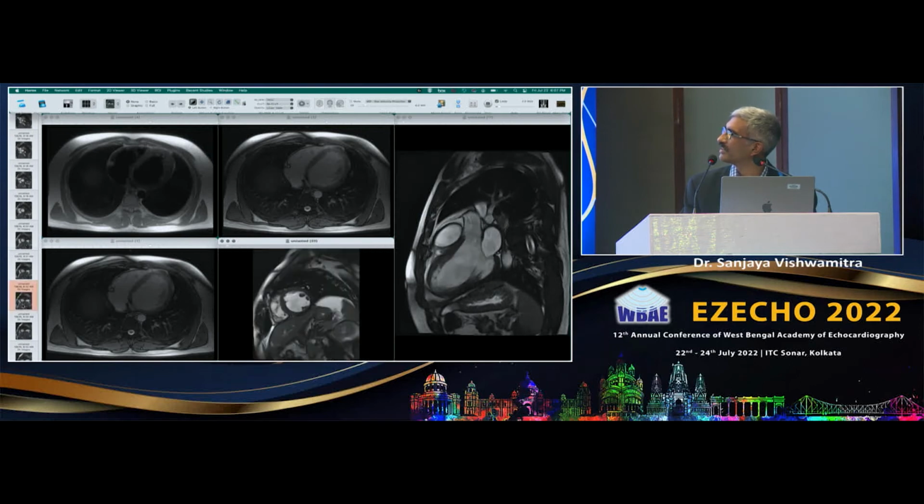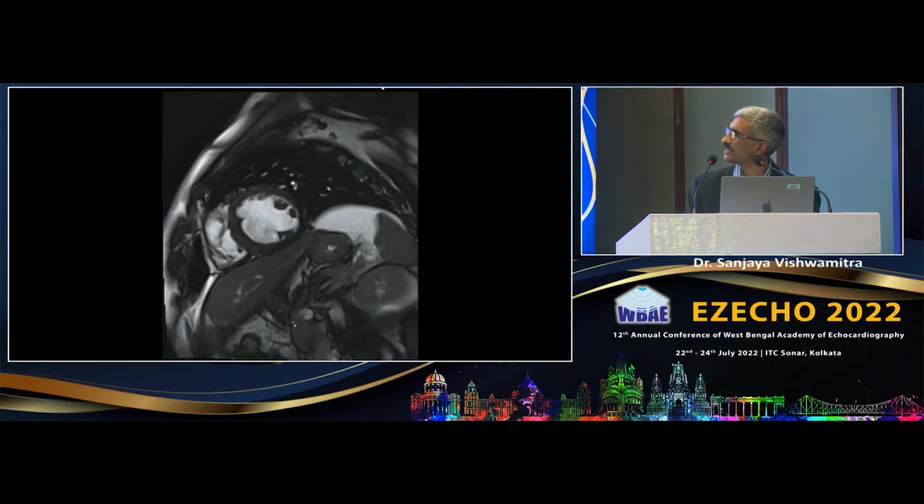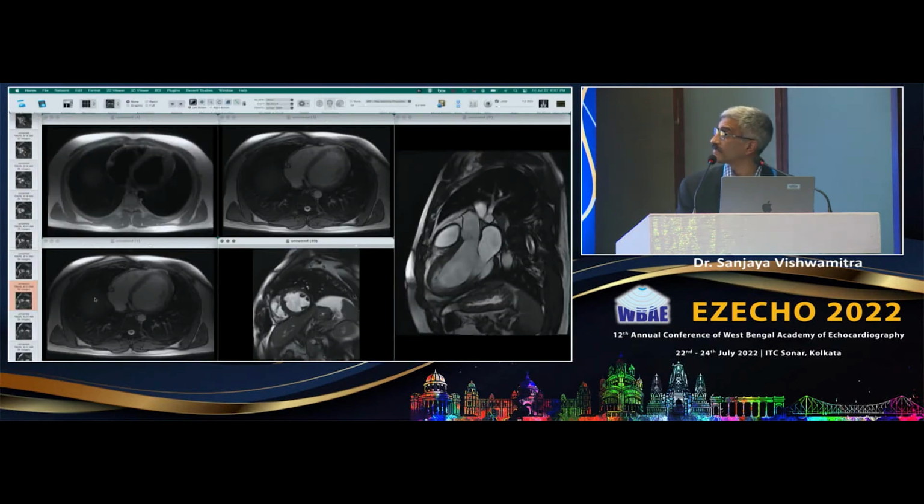What's this one? Okay. So this is just the short axis views, and this is where you can basically see the contractility. You can see the papillary muscles, septum, free wall of the right ventricle, inferior wall. And this is just how normal images look. This is what we try to get at for most of our cardiac images. Okay, let's see if I can go to the next one. I want to see if I can scroll down.